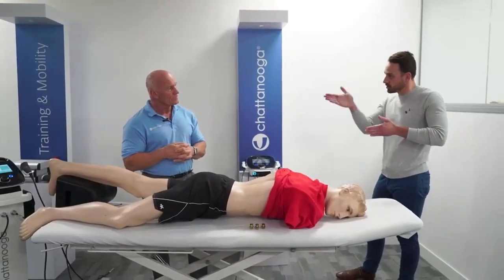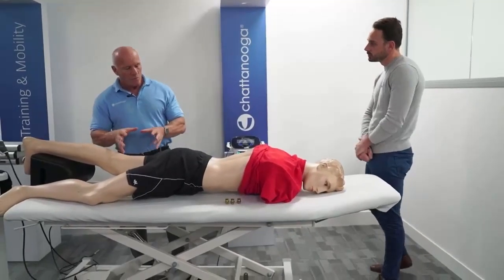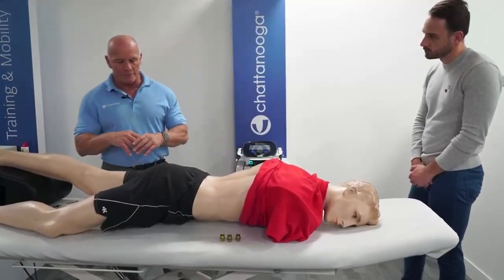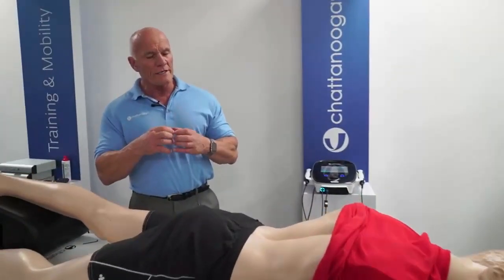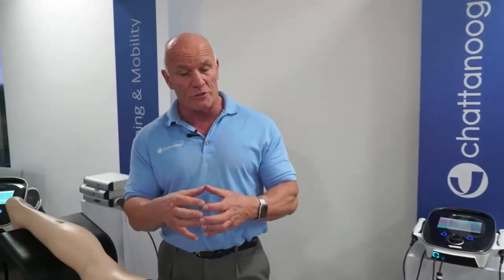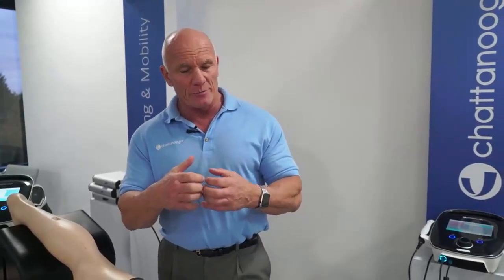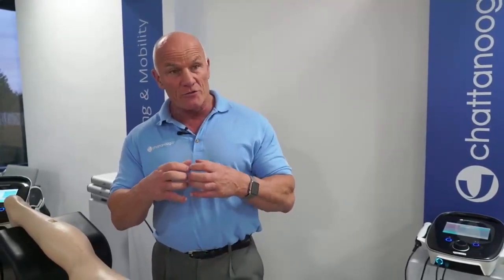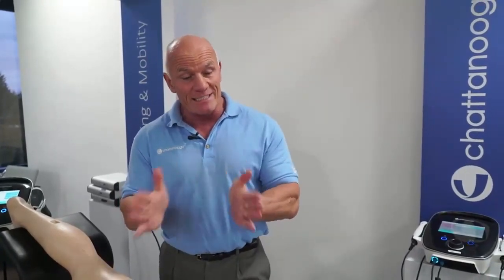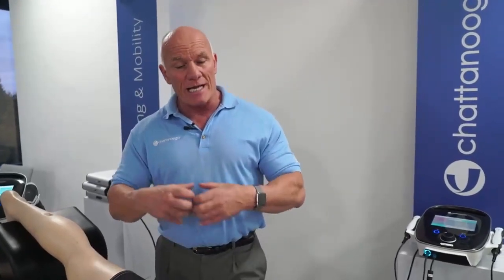Yeah, and that's really important, because when it comes to having an effect with radial pressure wave, what we know now from the research is radial pressure wave works for a multitude of pathology. Great study by Schmitz et al., a systematic review published in 2015. They took 365 pathologies and found radial pressure wave had an 89% positive outcome. Where we need to go now with research is what is the optimal protocol.